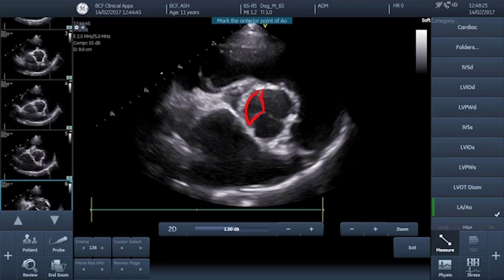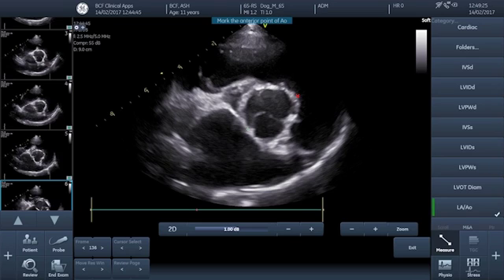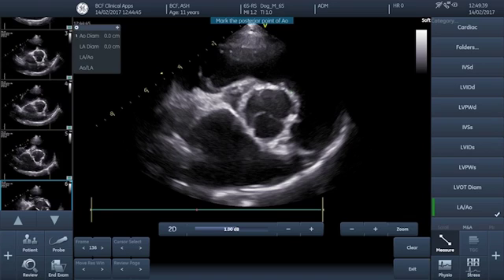Do we place the cursor on the luminal surface of the wall, somewhere in the middle, or on the outer surface? There is no 100% consensus or hard and fast rule, but the most commonly accepted method is the leading edge to leading edge method. Effectively, the right-hand surface of any wall thickness — as we move left to right across the image — is the leading edge, and we always measure from leading edge to leading edge. In this instance we place our cursor on the outer wall of the aorta at the right aortic sinus, extend the line across the diameter of the aortic root, and place the second cursor on the luminal surface of the opposite wall — effectively including that near wall thickness but not the far wall.